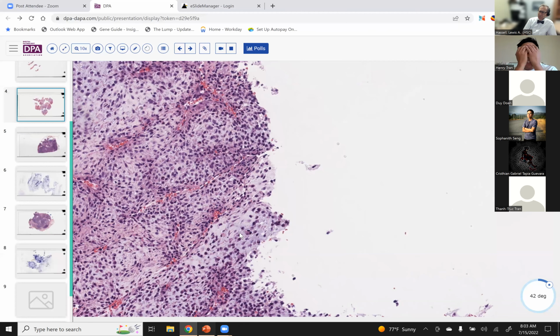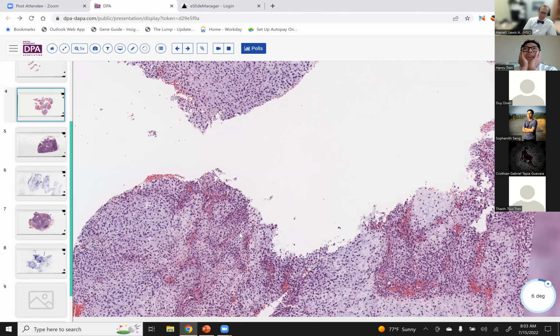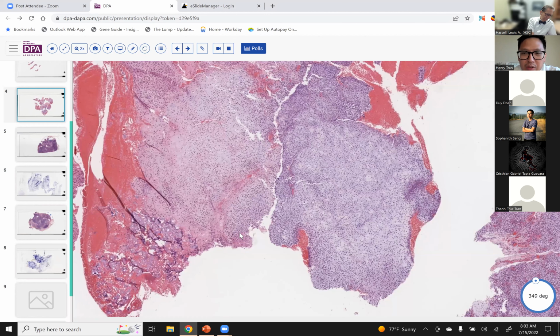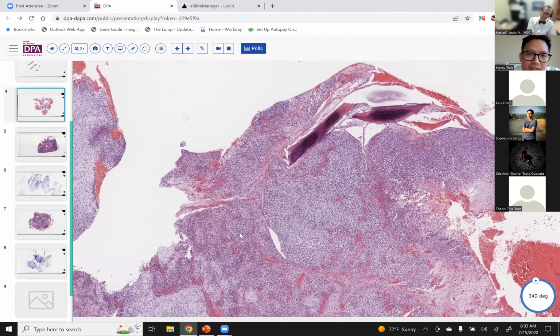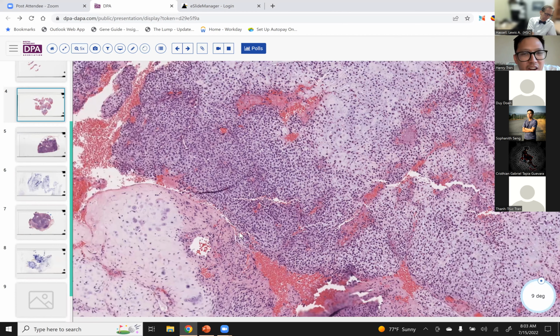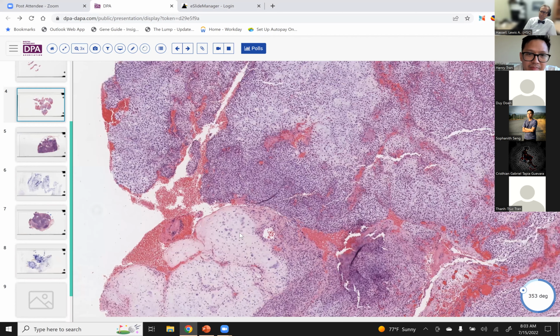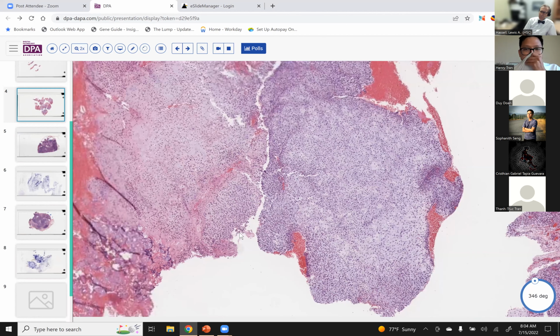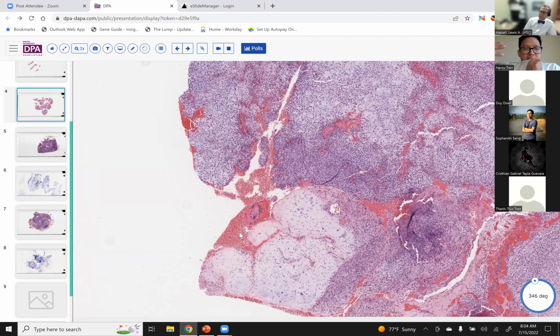Anytime we see GFAP positive tumors that have some chondroid differentiation, one thing I always think of is a myoepithelial carcinoma. And it's good that it had that strong GFAP positive expression. However, the S100 was negative, and the keratins were also negative. So that did not support it at all. But maybe it's a weird one. Who knows? So I kept that in the back of my mind.